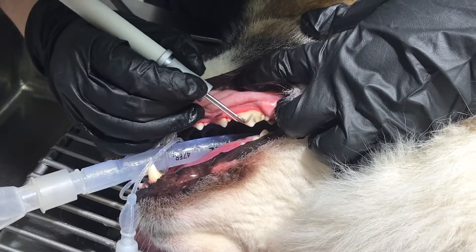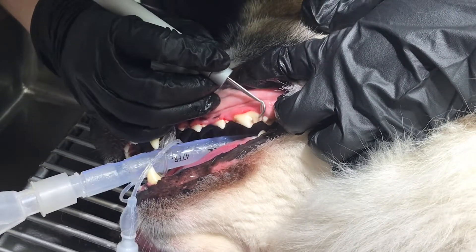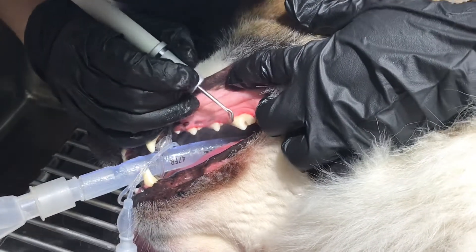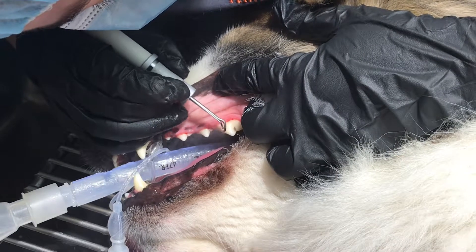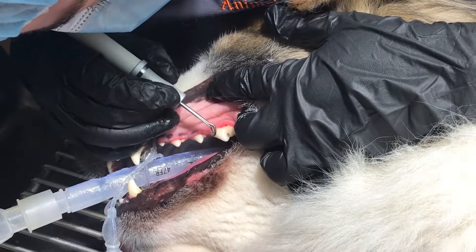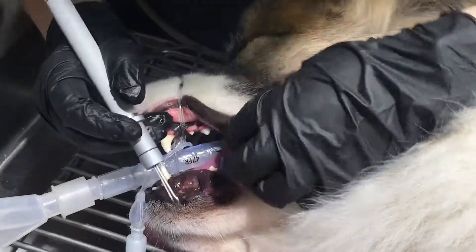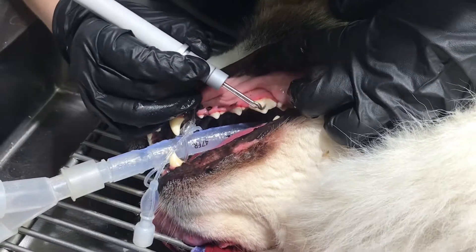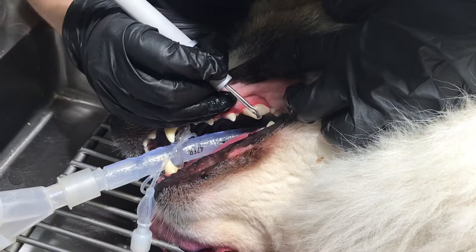One of the pre-meds that we give can cause those short, shallow breaths. Sometimes with those we just need to watch the oxygen and make sure it's not falling. If he's not responsive and what Sarah's doing isn't causing any response, we'll just allow him to breathe that way. Otherwise, if we need to, we can give him some deeper breaths with the machine and ventilate him manually, which can drive that panting response down if it's becoming too cumbersome to work around. As long as he's not responsive, it's always better to keep him lighter than deeper — it's walking that tightrope of being able to do what we need to do without getting them too deep.